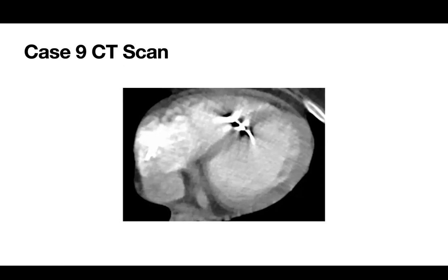I mean, to answer Dr. Rene, I don't think it's really apical. I think it's mid. I would say it's more than halfway. Looks like there's the apex and there's the septum. It's 2/3 of the way down, I would say.